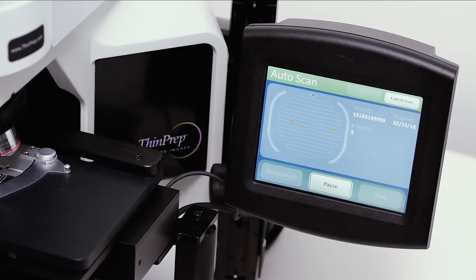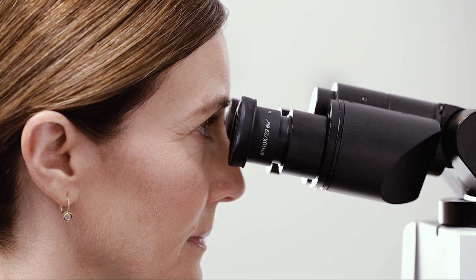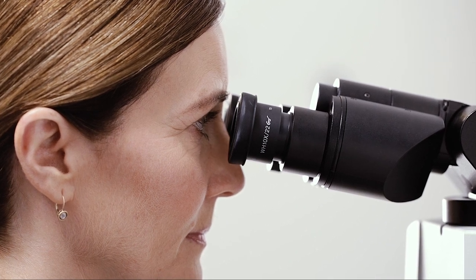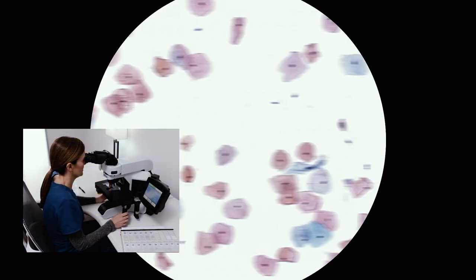A complete full slide review is required if the CT detects any suspicious cells within the 22 fields of view. The ThinPrep Integrated Imager guides the CT during the full slide review. The imager tracks the progress to ensure that all cells are accurately presented to the CT.